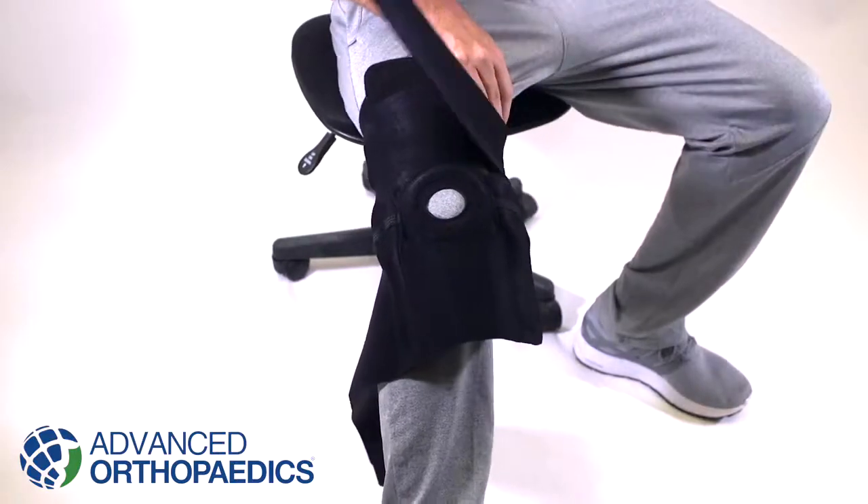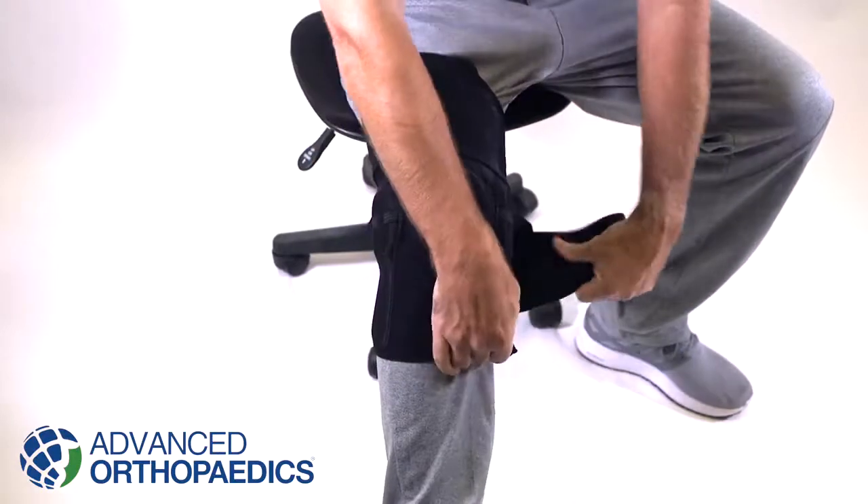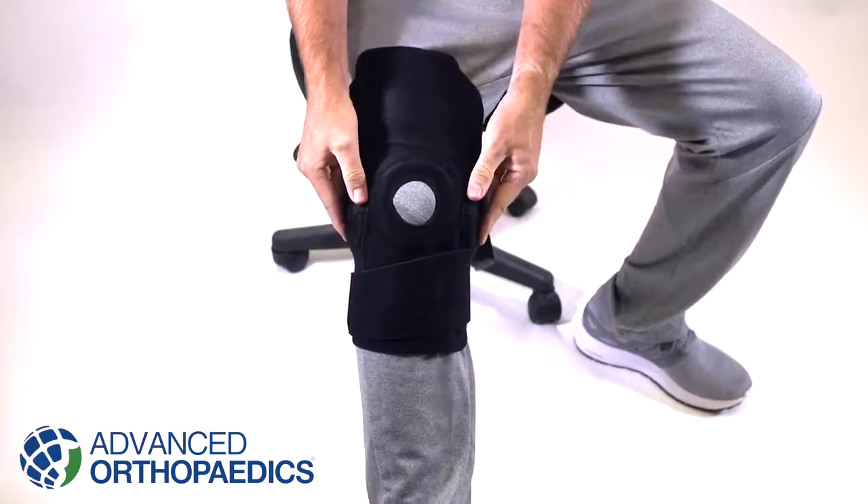Secure the top closure tab, then secure the bottom closure using the Velcro tab provided. Be sure that the hinges still align with the knee and the brace fits snug so that little movement is experienced.